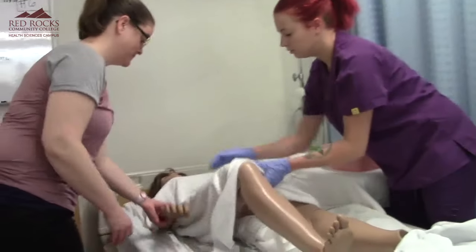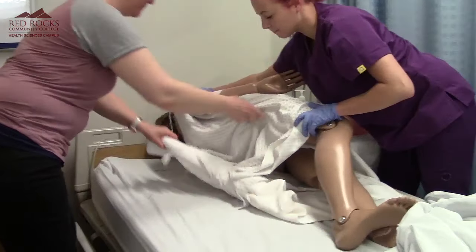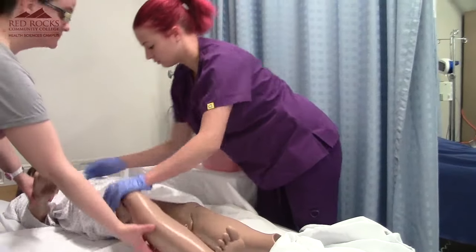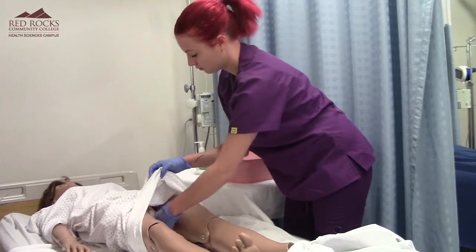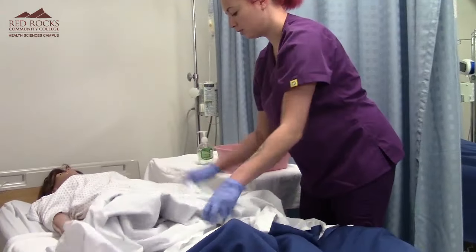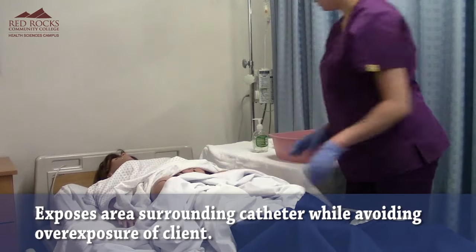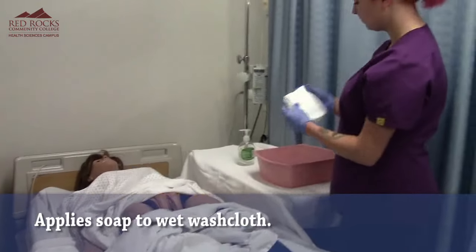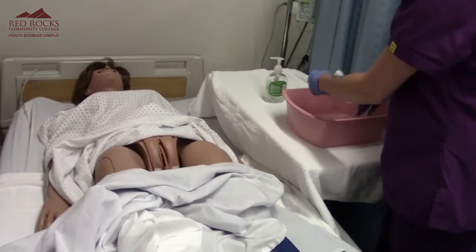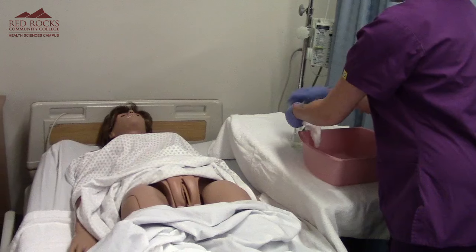I'm going to roll you off as well. We're trying to avoid overexposure, so I'll just expose the catheter area. I'll get this washcloth wet, bring it out, and put soap on all four corners of the washcloth.